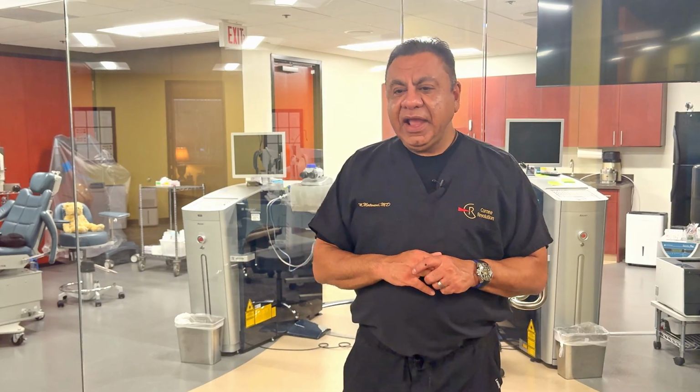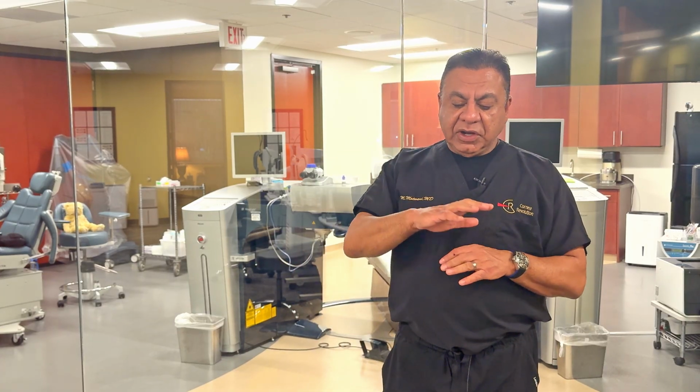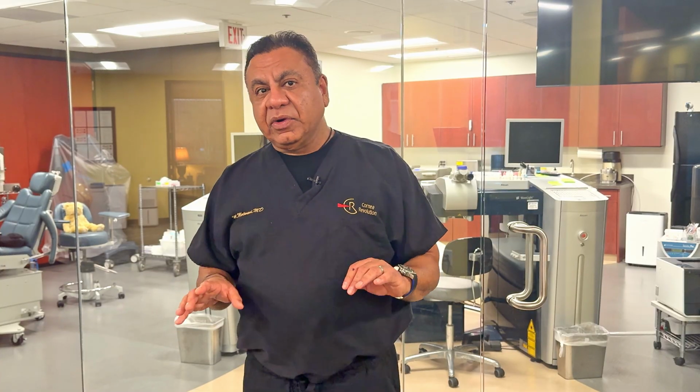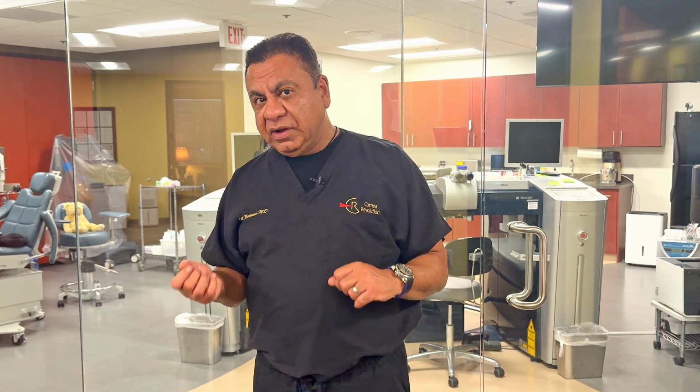A lot of times you can remove the actual white opaque tissue, okay? You can do that with laser. That's called PTK. PTK will remove a certain amount of tissue to get down to clear cornea, get below the scar. And believe it or not, most corneas actually have quite a lot of tissue that you can PTK. In other words, even after you lose some from an infection or trauma, there's quite a lot. So you can actually very successfully get below the scar.